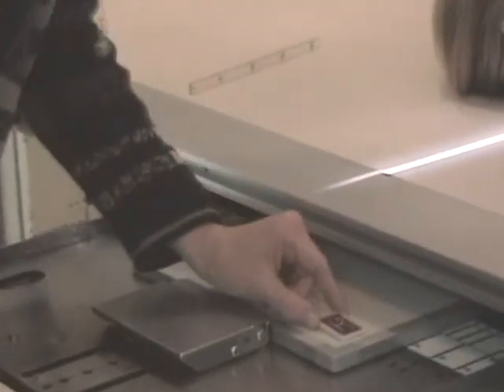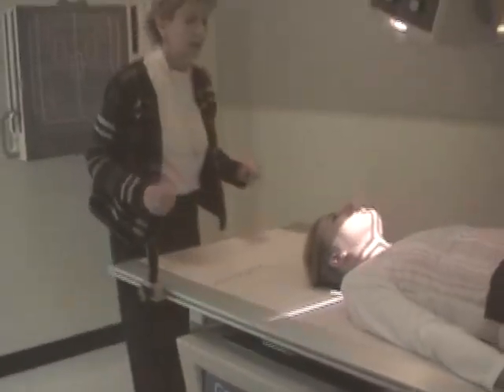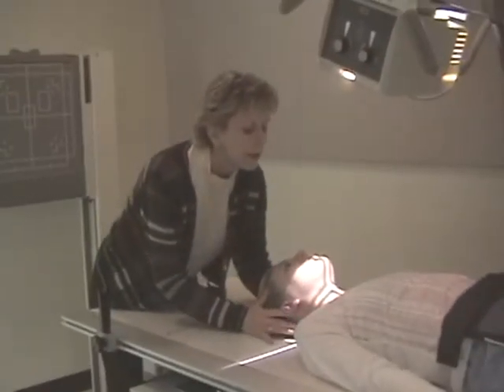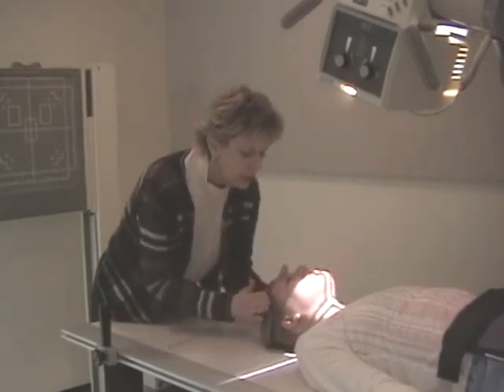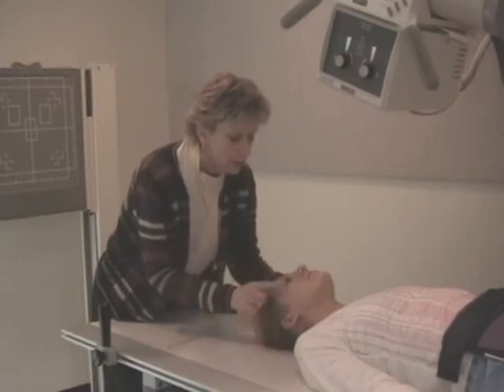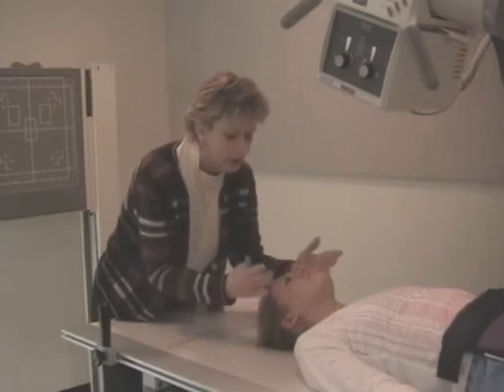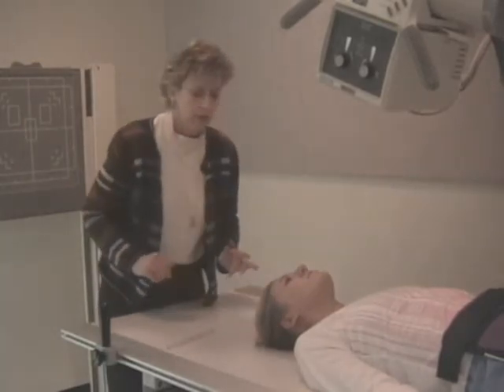Right marker on there, in a ways, because I'm going to collimate. And the last thing you have to do is come to the head of the table. Her MSP is to the center of the film, and I make sure that her skull is straight and that the MSP of the skull is not rotated. I'm looking at her eyes out to the side, and that would be an AP projection.